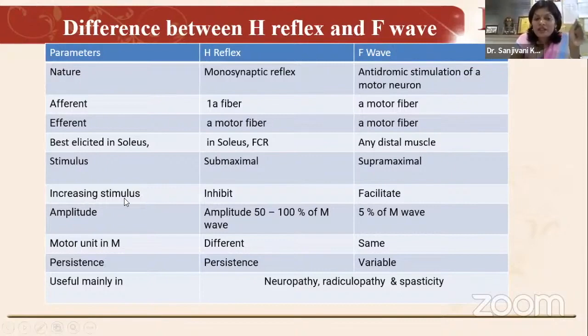When we increase the stimulus, the H reflex gets inhibited. When I initially showed you on the monitor, as we were increasing the intensity, your H reflex disappeared and we were getting the M wave. In the F wave, increasing the stimulus facilitates the F wave.